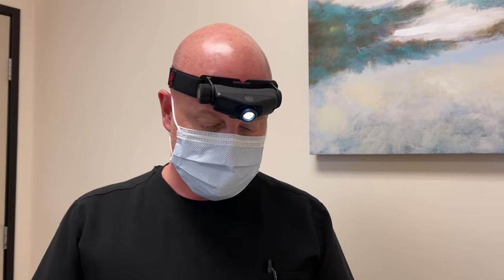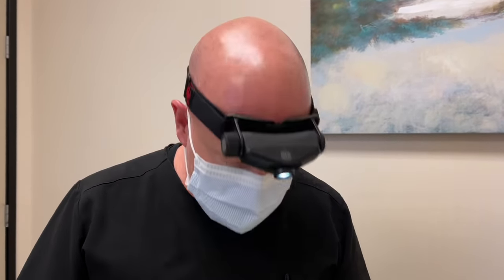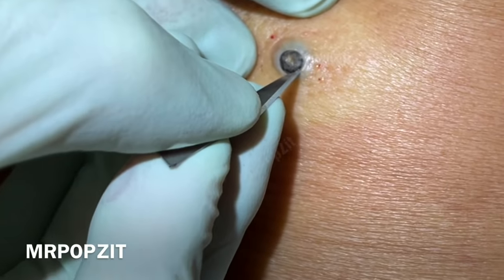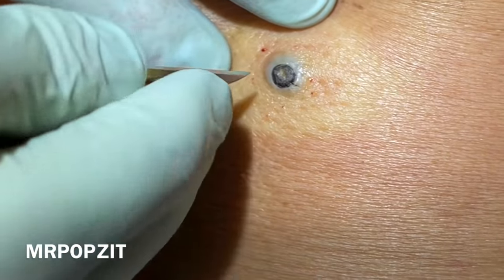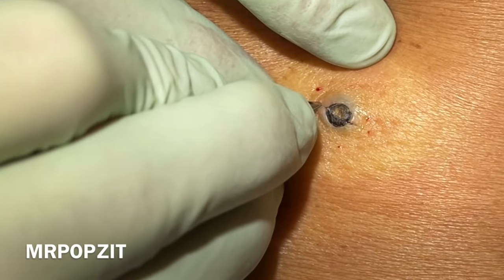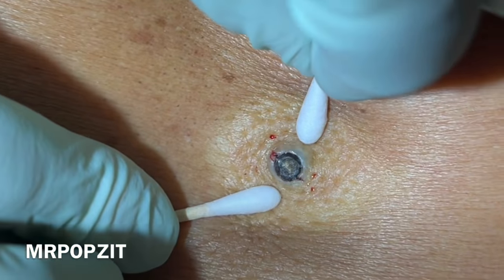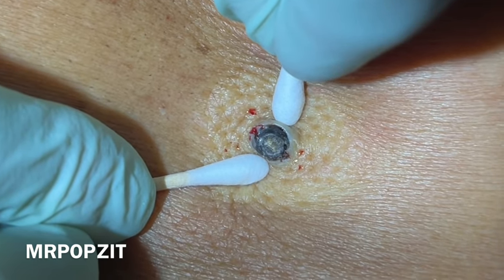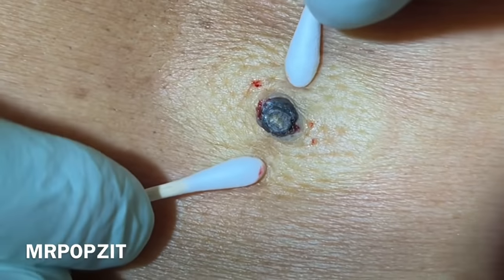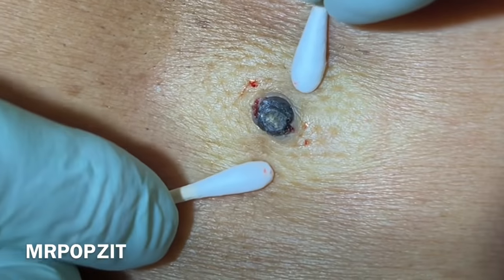We have the dilated pore of Winer, nice and numb here. We are just going to scrape the skin at the edge here just to open that up on each side, because that's what's holding on to it — kind of like an episiotomy. Take some Q-tips here on each side and we're just going to gently put some downward pressure here.